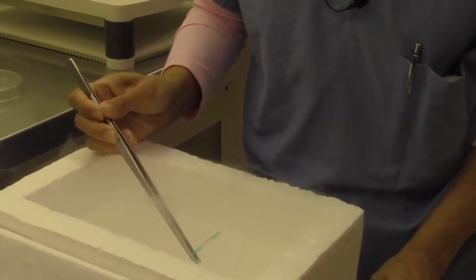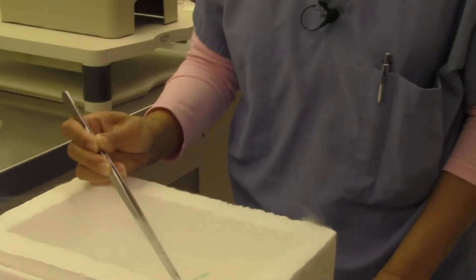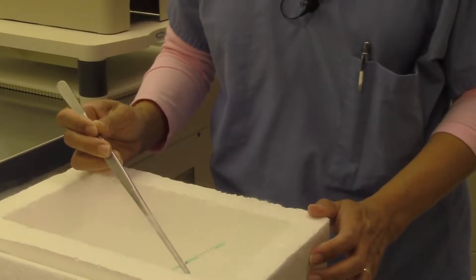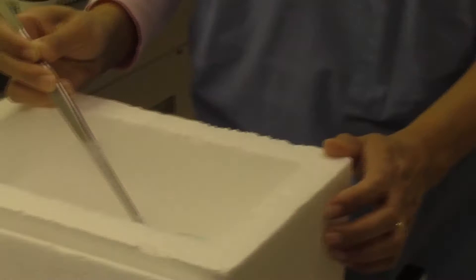The straws are labeled with the patient's name, social security number, or if it's an egg donor, with their code and the date that they were frozen. As you can see, the straw is color coded, so we're able to maintain them by the code or name of the patient.